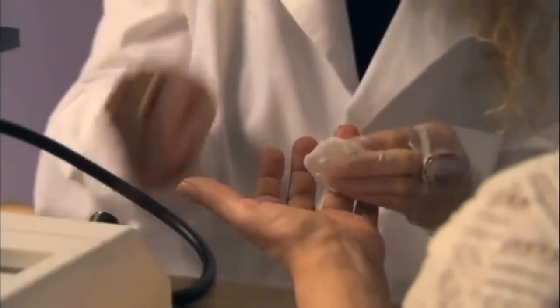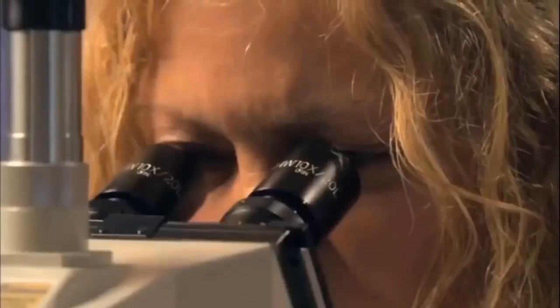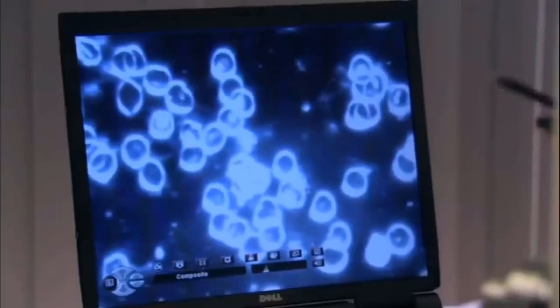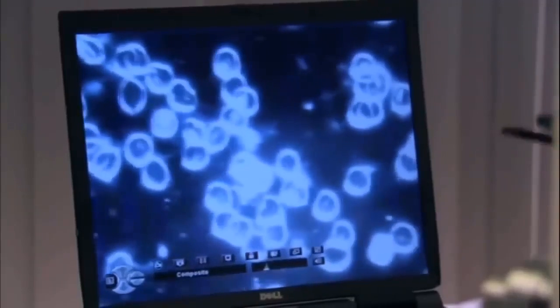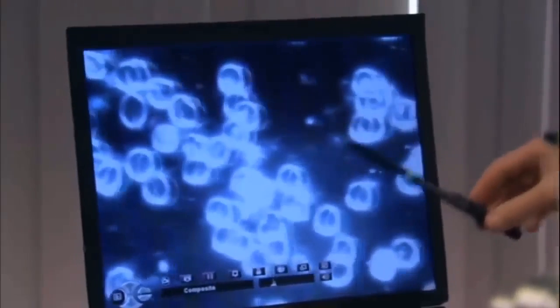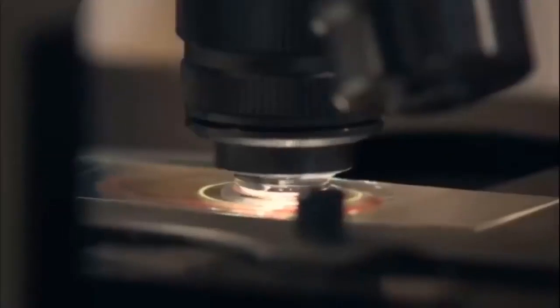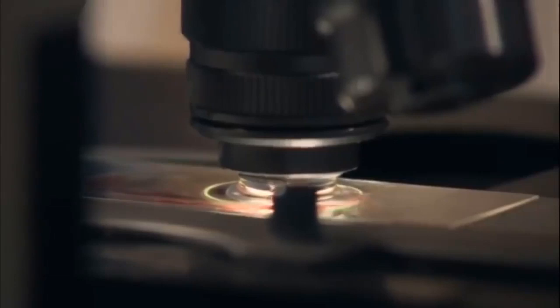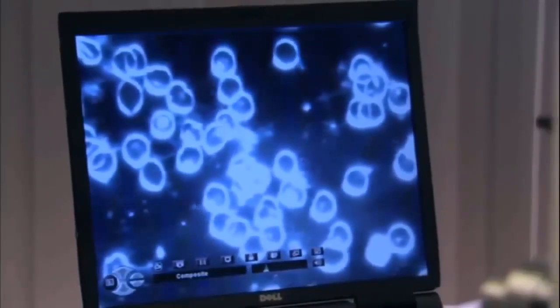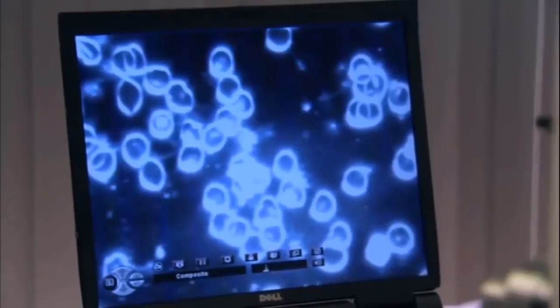After 12 minutes, the doctor again draws blood from the patient and studies it. So you can see that the cells then become buoyant, they become slippery, and they have their electrical charge, so they repel each other. That allows them to carry oxygen, and it means that we're changing the pH of the blood back to an aerobic environment rather than an anaerobic environment.